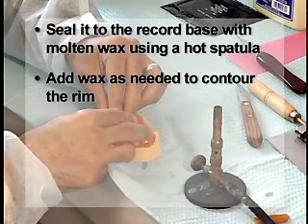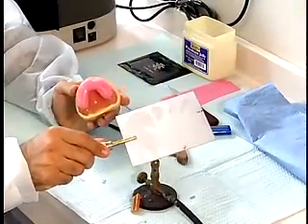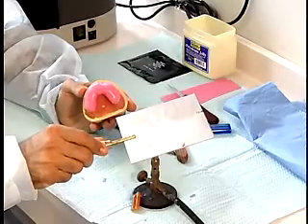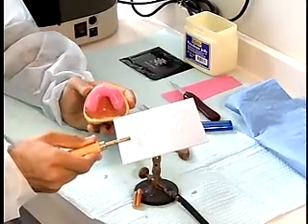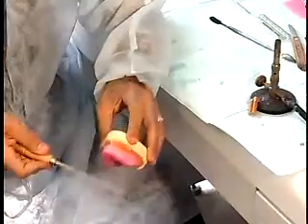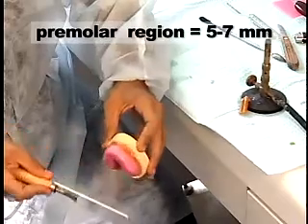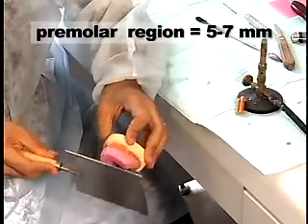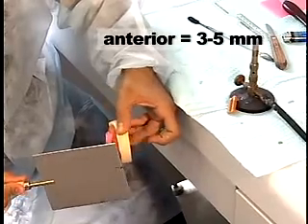Remember, the facial surfaces of the central incisors are 5 to 9 mm anterior to the center of the incisive papilla. Use a pancake turner or a heated wax spatula to develop a flat occlusal plane. The width of the occlusion rim in the molar area is 8 to 10 mm, 5 to 7 mm in the premolar region, and 3 to 5 mm in the anterior.